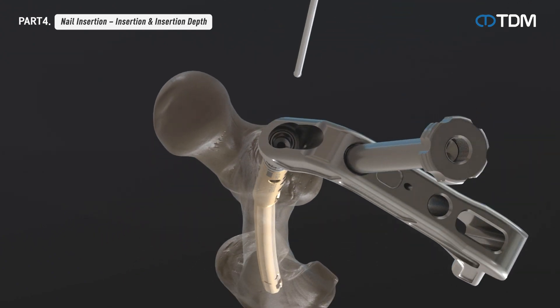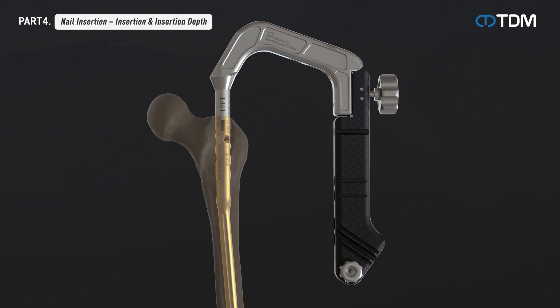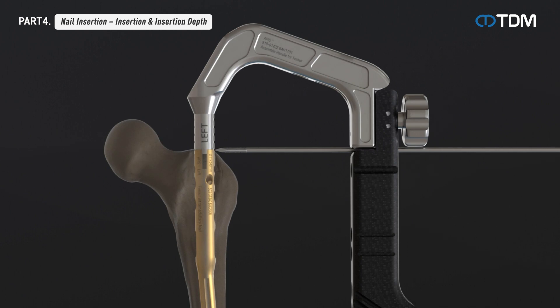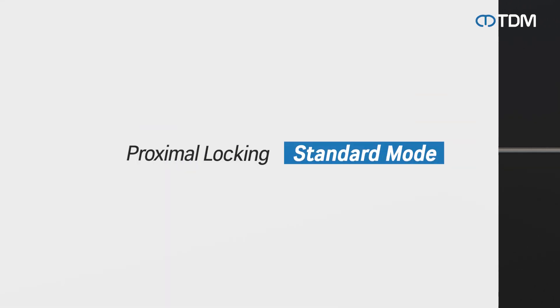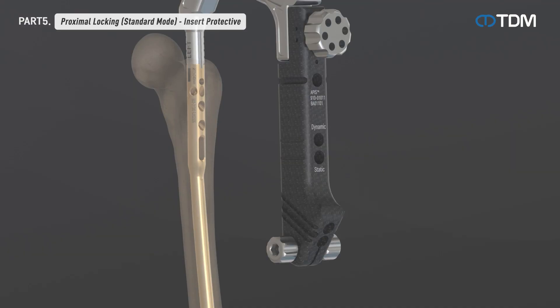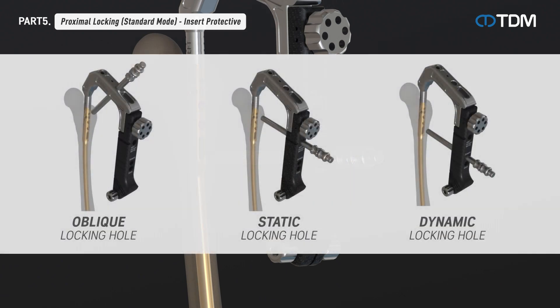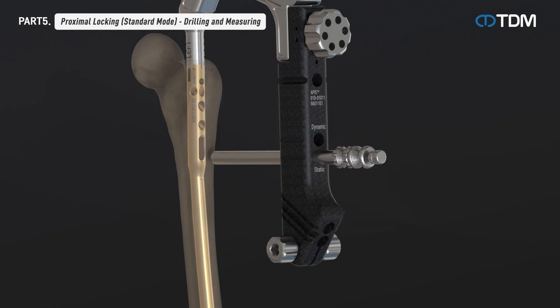Remove the reaming rod, assemble the target guide on the assembly handle, and insert the guide pin into the nail end point targeting to check the depth according to the end of the nail. After selecting the screw hole suitable for standard mode, insert the sleeve combination for standard mode. Standard mode has two screw types that can be selected and applied according to the type of fracture or the doctor's preference. Remove the trocar from the standard combination of protection sleeve, drill sleeve, and trocar, then drill until the drill bit penetrates both cortices.